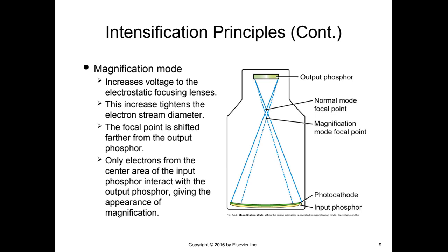All right, but if we're magnifying an image, of course, the trade-off for that in that particular area, we're going to have increased dose to the patient. And the reason for that is since we have collimated out some of the available x-rays that were available, the machine is going to automatically increase the dose in that area to account for some of those missing x-ray photons.